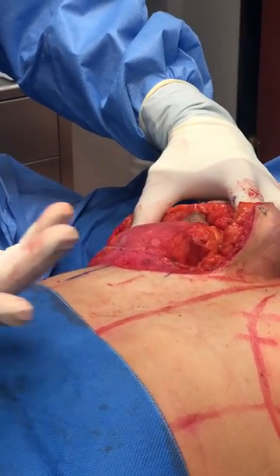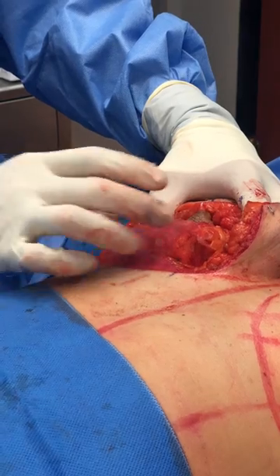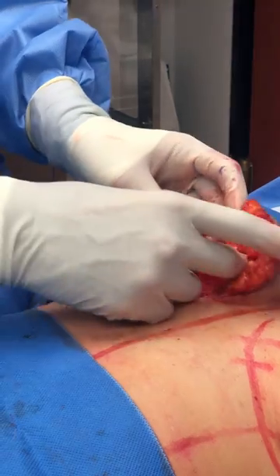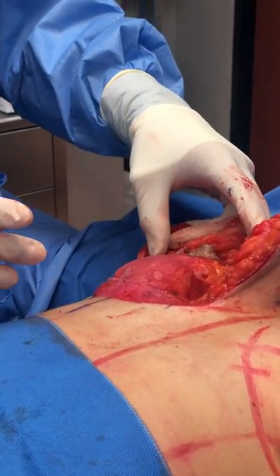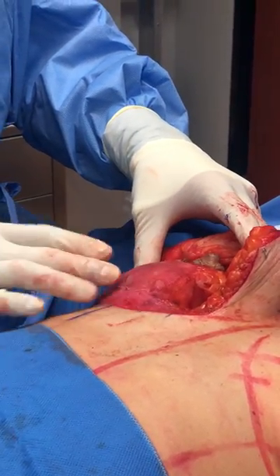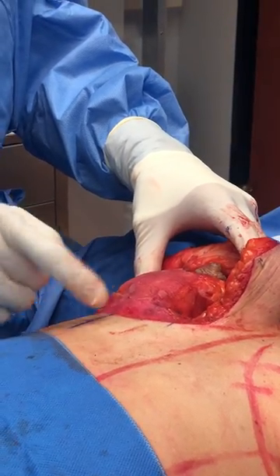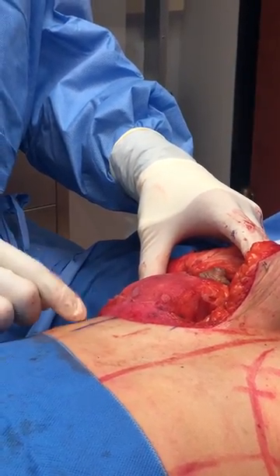It's Galliform, Gallashape, and Gallaflex. What we use here — we use the Gallashape in a mastopexy to reinforce this soft tissue, so it creates almost like an autologous implant but reinforces it down here at the inframammary fold. I put it in a little above it in case there's ever a little wound or anything, so there's no exposed mesh.